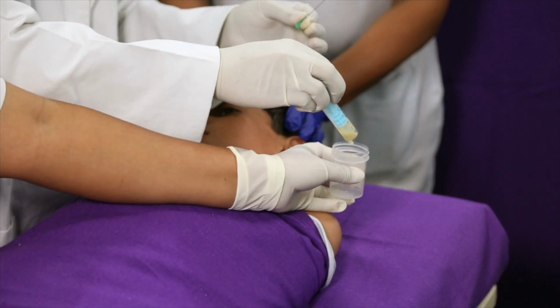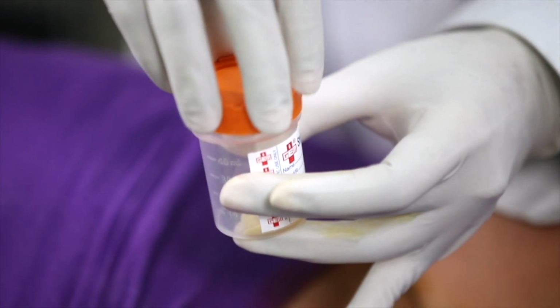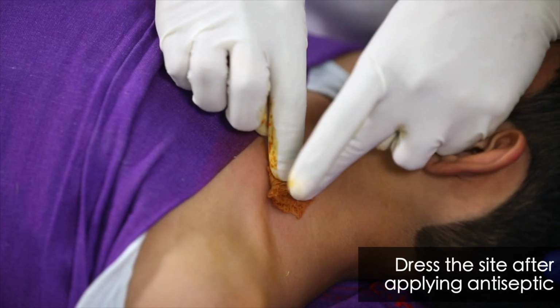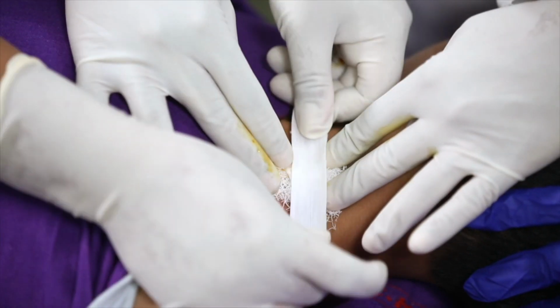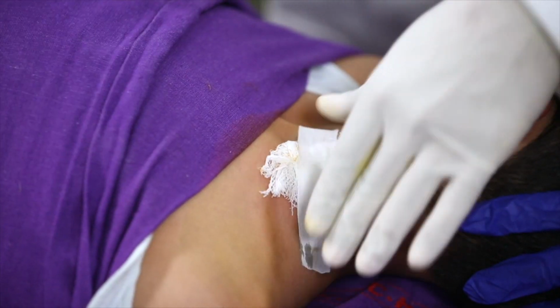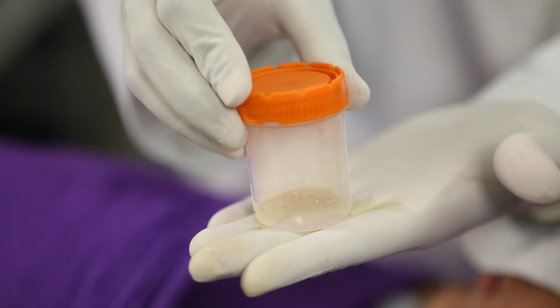Aspirate may be taken from multiple swellings and pooled before sending to laboratory for bacteriological confirmation. At the end of the procedure, dress the site after applying antiseptic. Send the aspirated collection to laboratory for further processing.